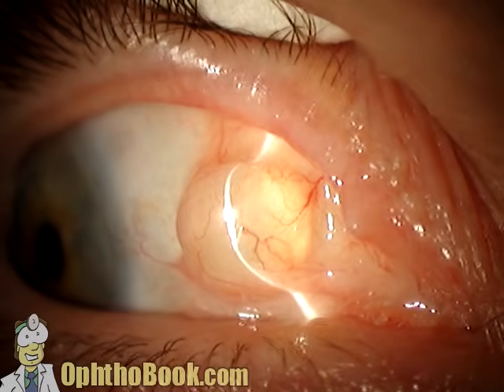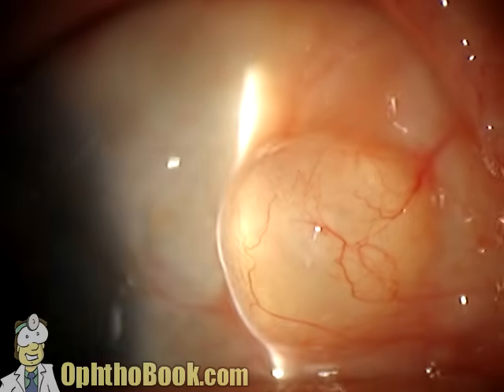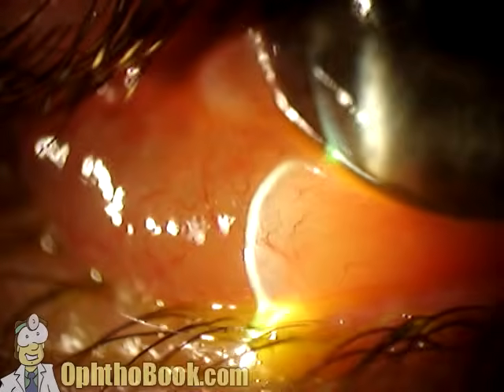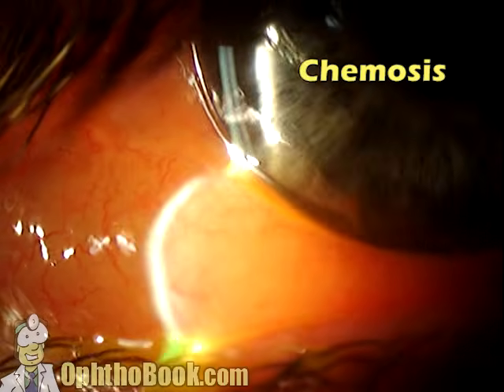It's benign because it's clear, and anytime you have something clear, you can always use your thin slit beam and get a good cross-section and gauge depth a little bit closer. This is swelling over in the white part of the eye. This is chemosis, usually associated with allergy.